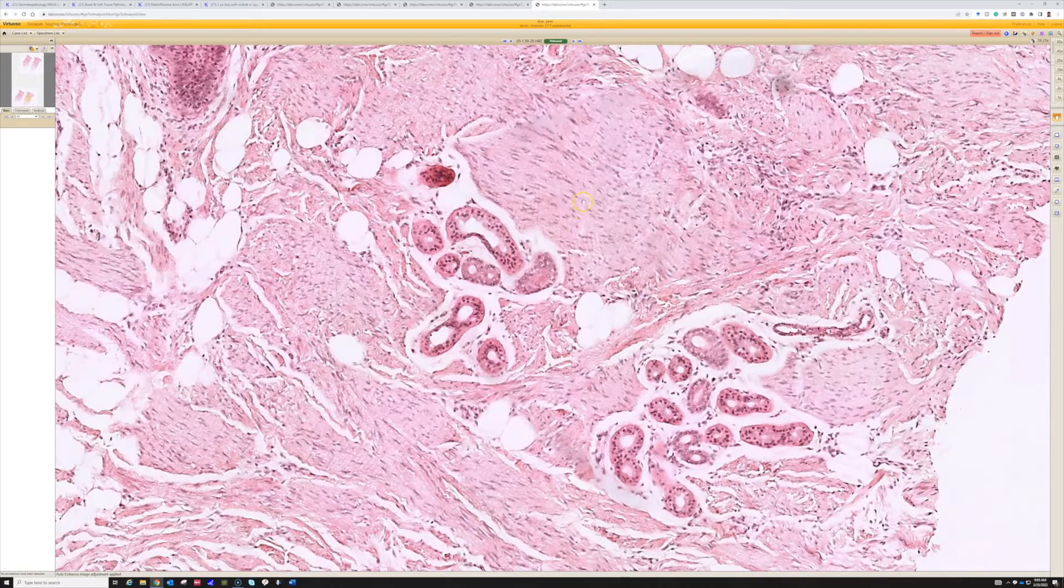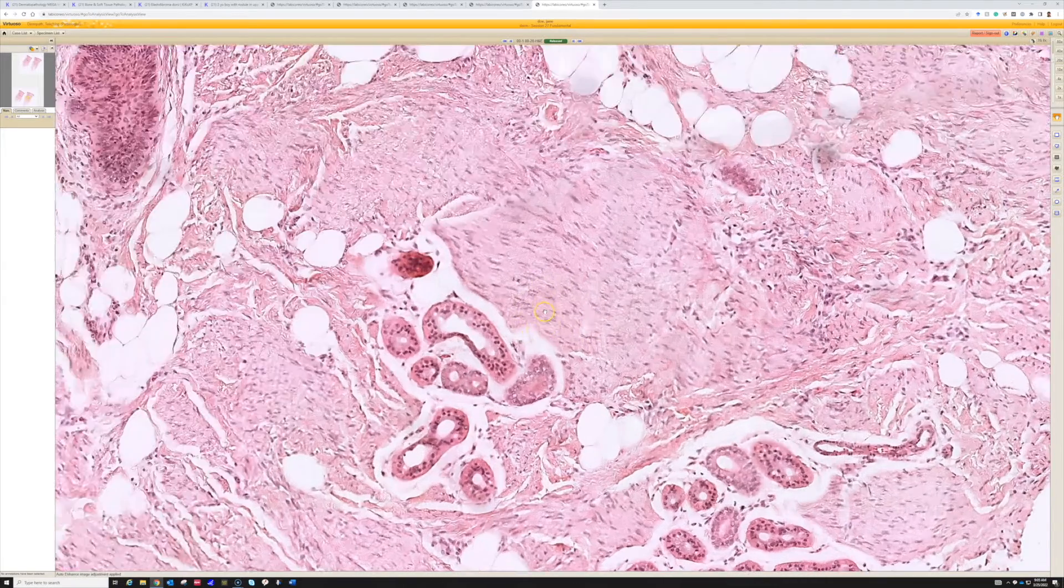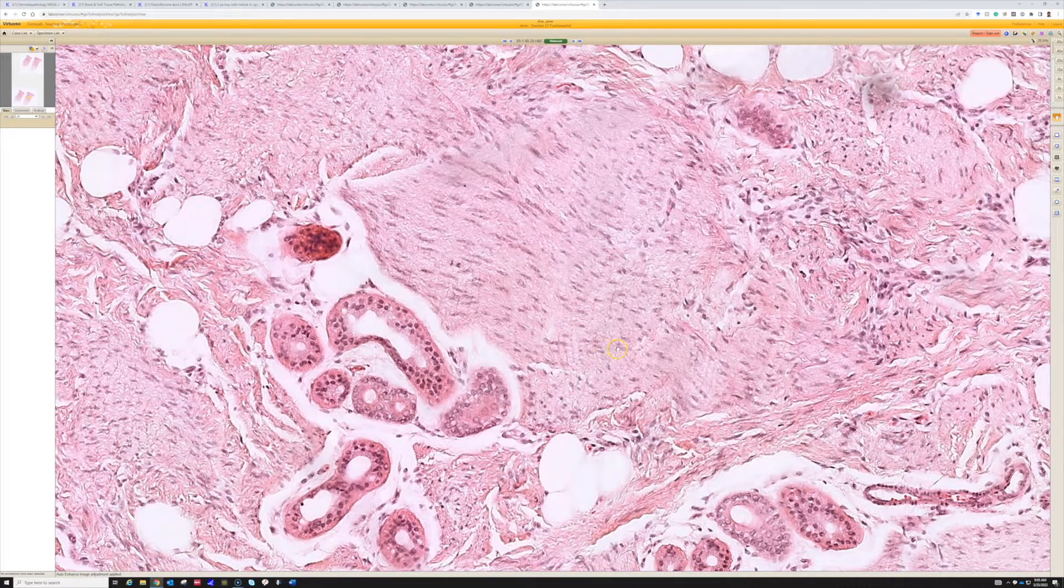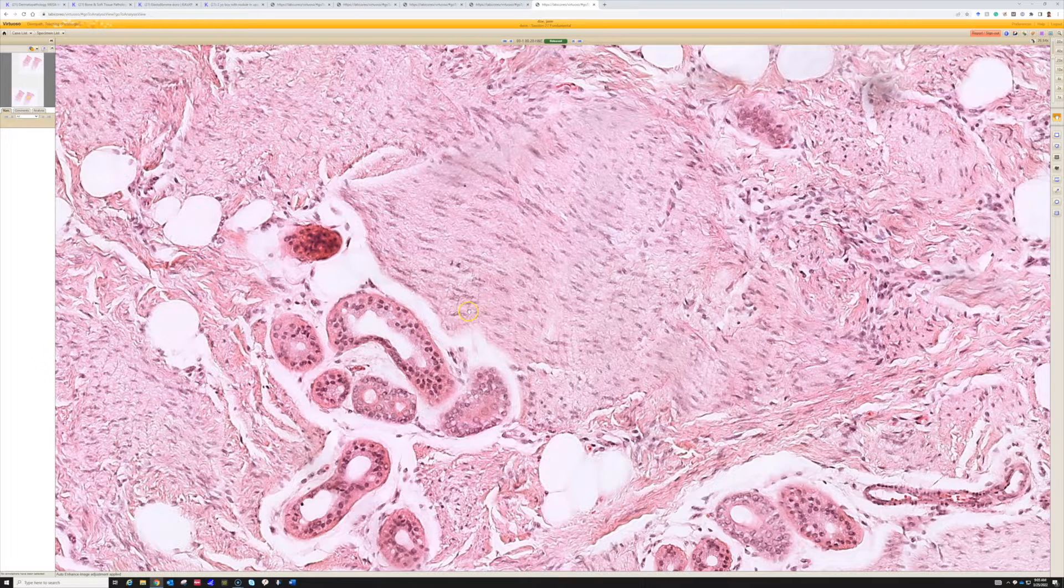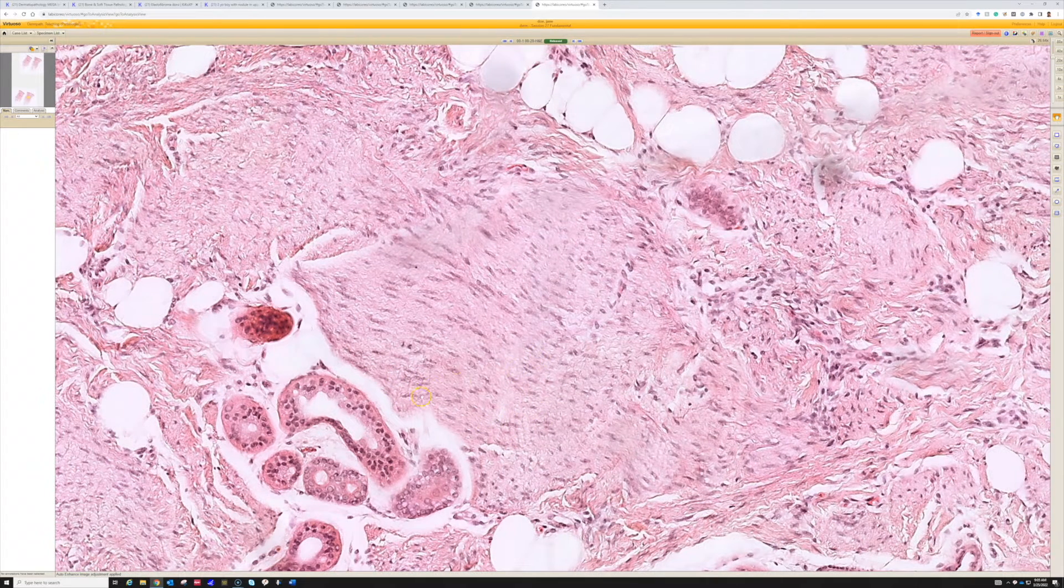So the parallel fascicles is the key. And if you've not watched it, I've got a video about the ramen noodle sign. Fibroblastic and myofibroblastic lesions, they tend to get this really wrinkly, rippled kind of waviness to them that sometimes people see and they think is nerve.